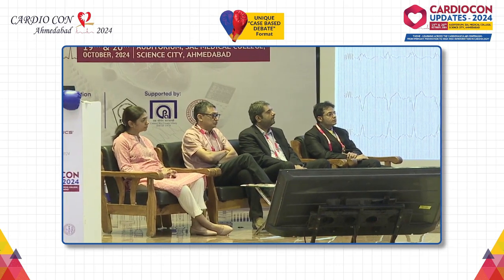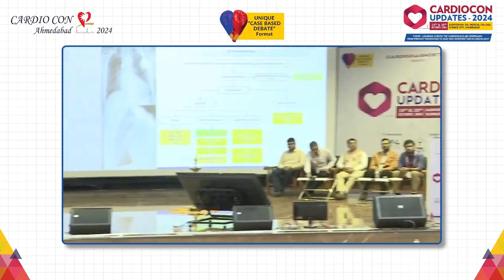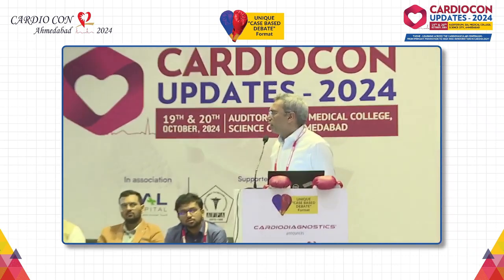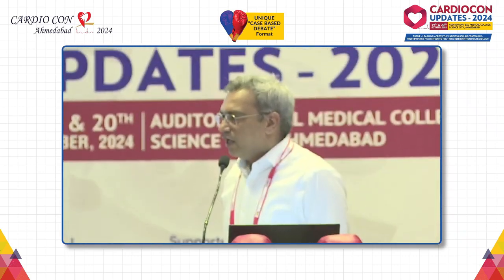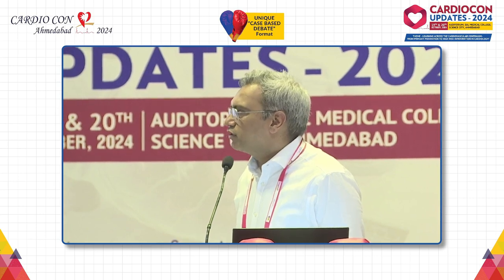Probably later on, upgrade I would not consider a very good option. If you look at all of electrophysiology, upgrade has the highest complication rate, not only hematoma, infection, requirement of transfer, everything.